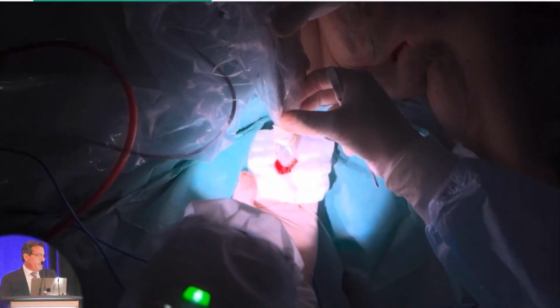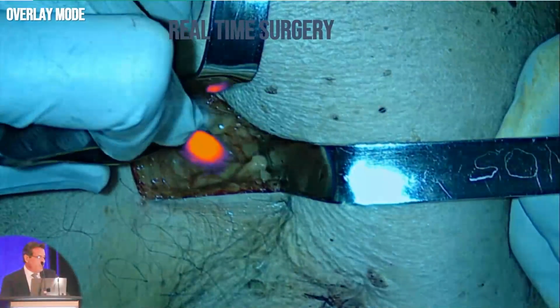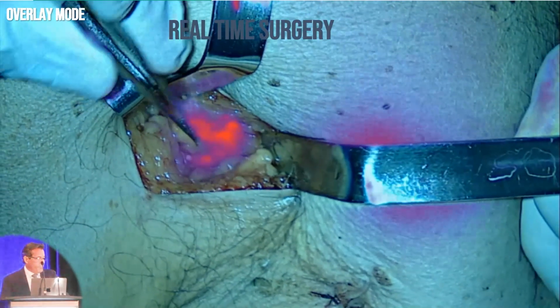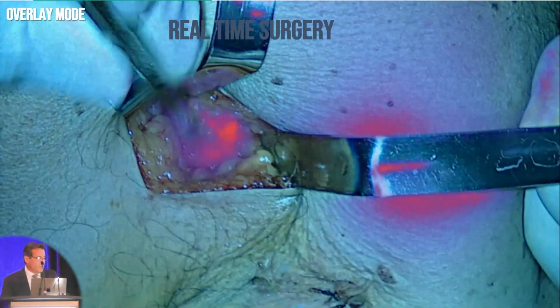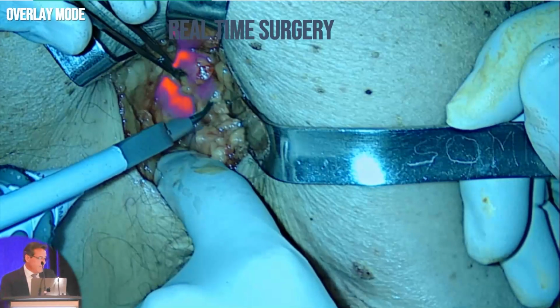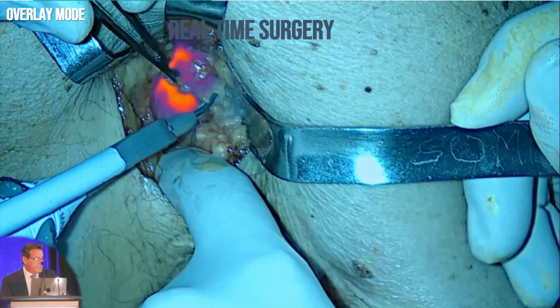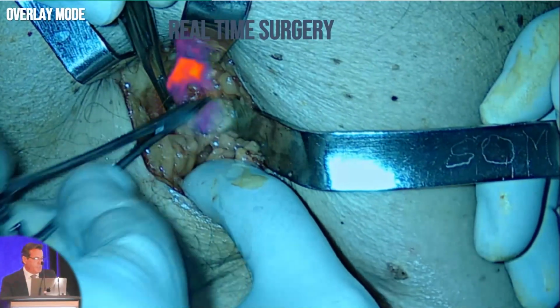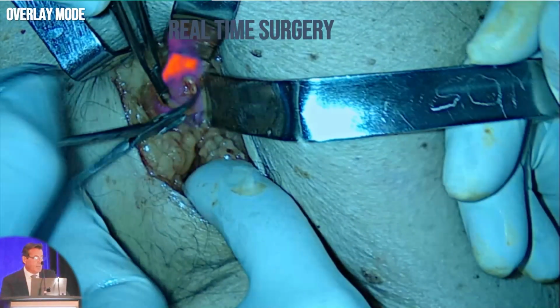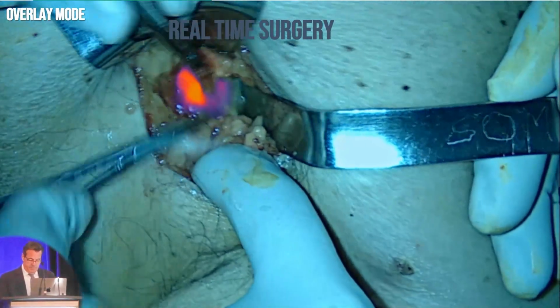Another video in real time. Again, you can see perfectly the difference between the lymph node and the fat tissue around the lymph node. You can use, of course, a focus to dissect the lymph node. And this is a procedure that you can sometimes perform with local anesthesia, depending on the patient.